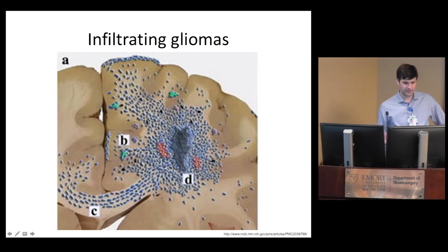They'll do this in an interesting fashion. They show some of the properties you would expect of normal glial cells, i.e. they orient themselves towards structures that usually need some type of glial support or protection. So they'll orient themselves to neurons.